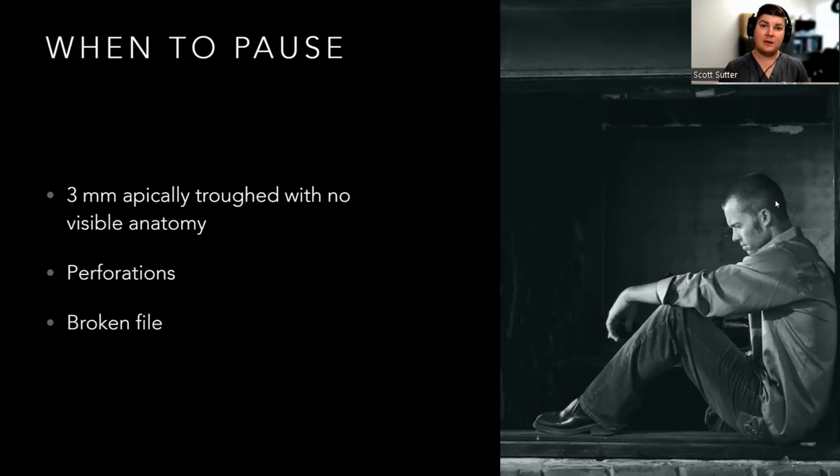Broken files, if you can get them out, and if you get them out obviously right then, but if it's pretty far down, take a break, come back, try again another day. Especially if you feel yourself starting to get frustrated. So much of endodontics is your mindset. If you are struggling and just cannot get down something, take a break, take a breath, go have a cup of coffee, come back another day and try again. You will get a lot better at this as you start practicing, but it's very common to become frustrated with these cases.